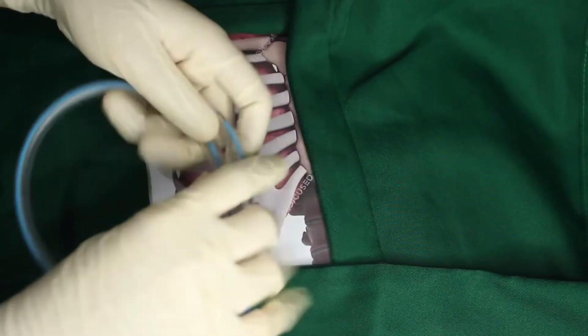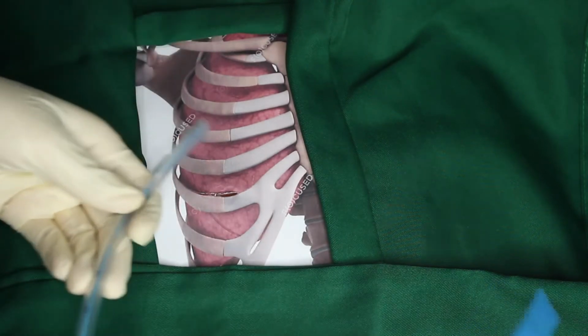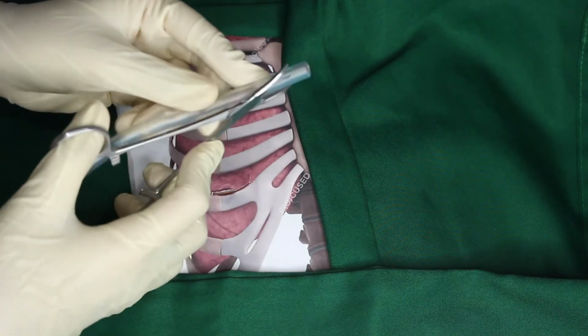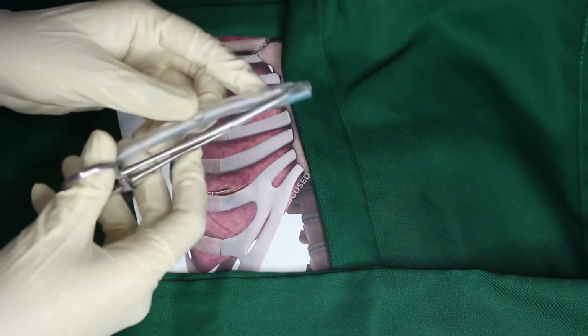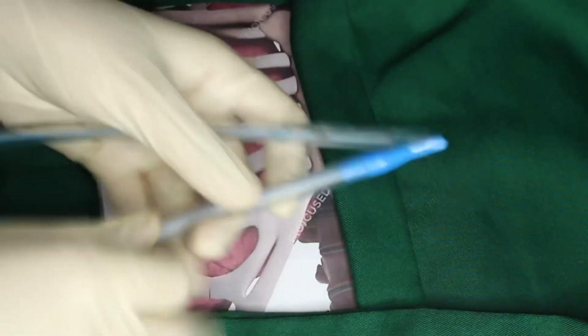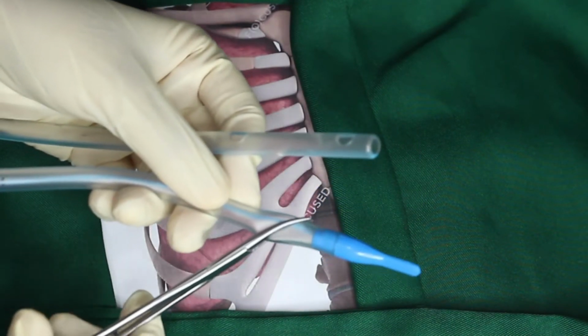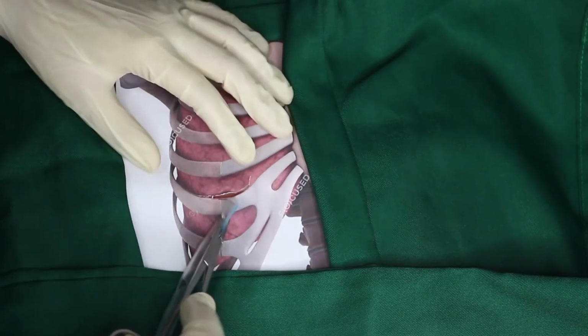Select the tube to be used. Note the location of the holes and the distance of the proximal hole to the tip of the catheter. Grasp the tip of the tube with a long Kelly clamp so that the long axis of the clamp is almost parallel to the long axis of the tube. If hemothorax is suspected, it is also advisable to clamp the very distal end of the tube to avoid making a mess. Insert the tube into the chest using the large Kelly clamp as a guide.